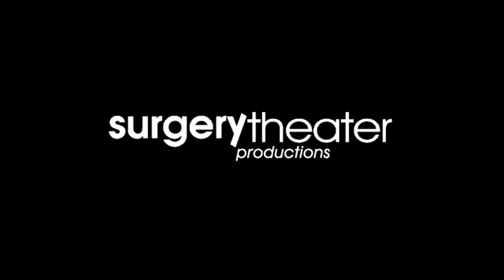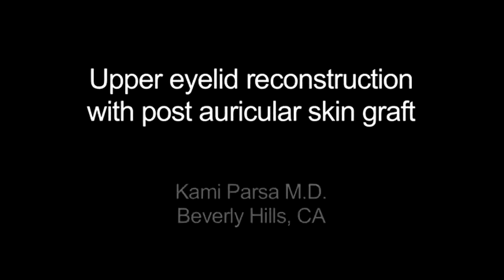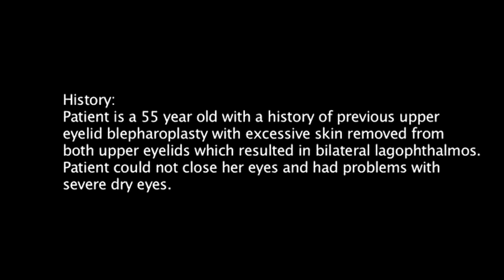So this is a surgical video of upper eyelid reconstruction with post-auricular skin graft. Patient is a 55-year-old female with a previous history of upper eyelid blepharoplasty. Unfortunately, during the procedure, the surgeon removed too much skin from both her upper eyelids, and this resulted in her inability to close both eyes.